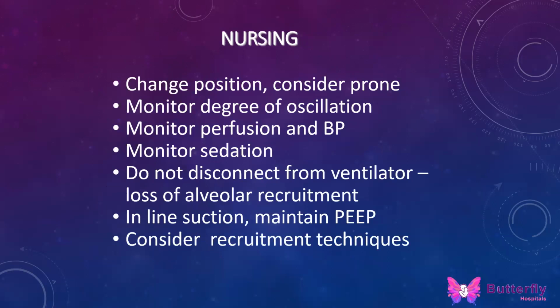So what is the nursing instruction that you need to give when you put the baby on high frequency ventilation? Basically about the positioning of the baby, the secretions, and the blockage of the ET tube that need to be avoided. And one of the things that we need to remember, whenever the baby needs suctioning, disconnecting the ventilator in high frequency ventilation mode can actually de-recruit the lungs. So it is important to have a closed suction system when the baby is on high frequency ventilation to prevent the de-recruitment of the lungs.